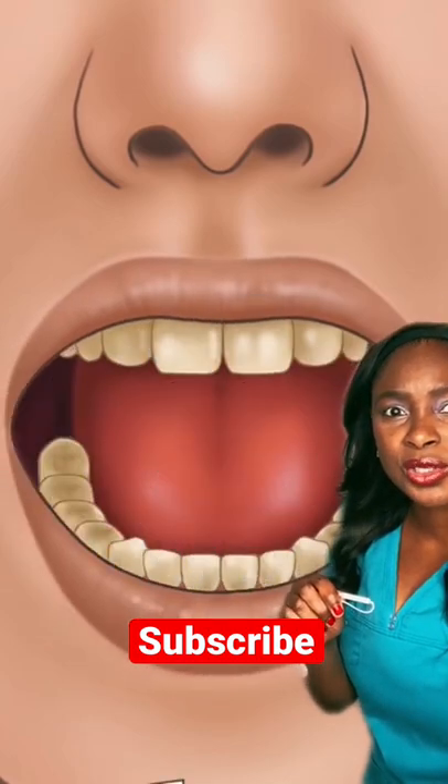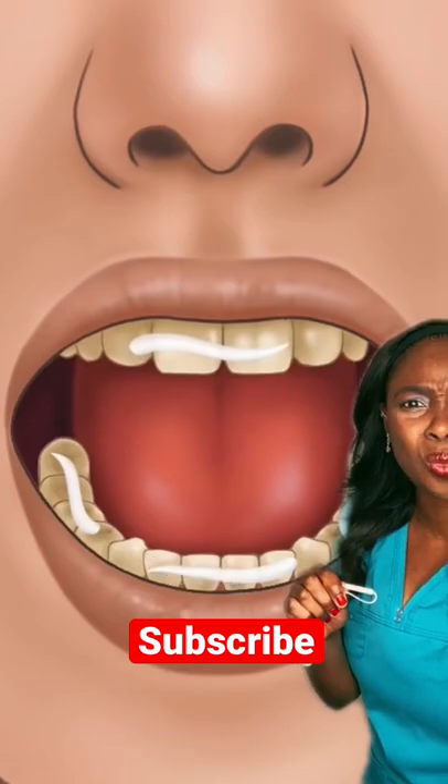And now we're going to take out the cotton roll, and now we've decided we're going to whiten their teeth.